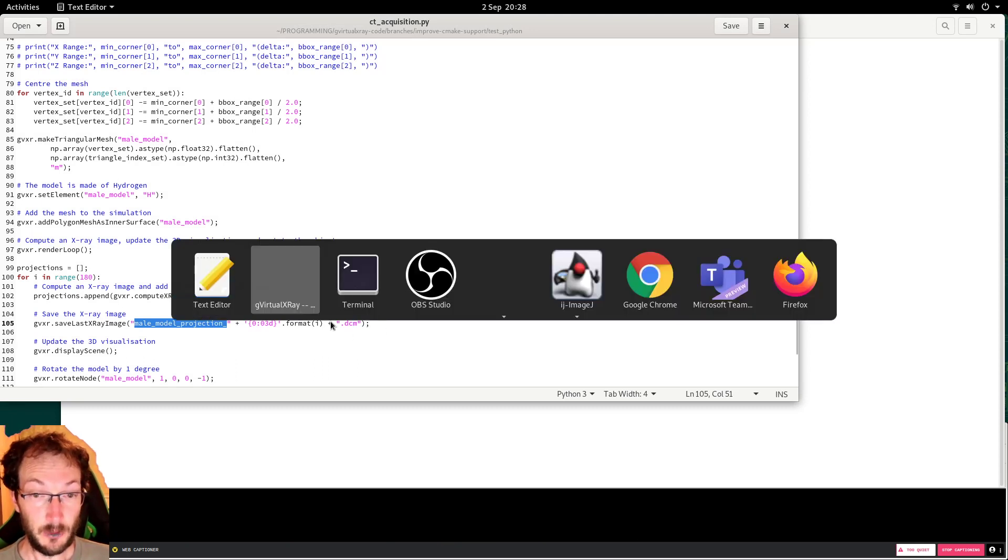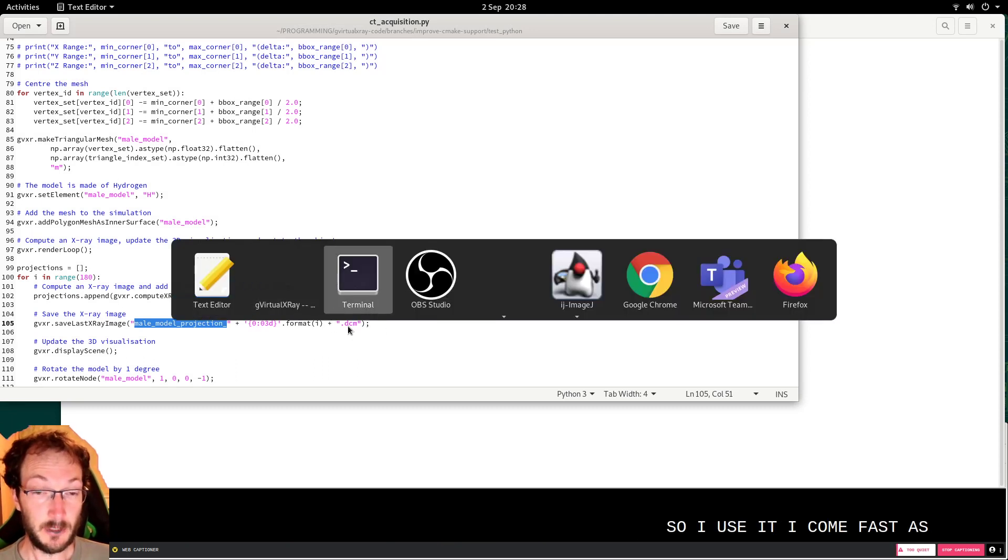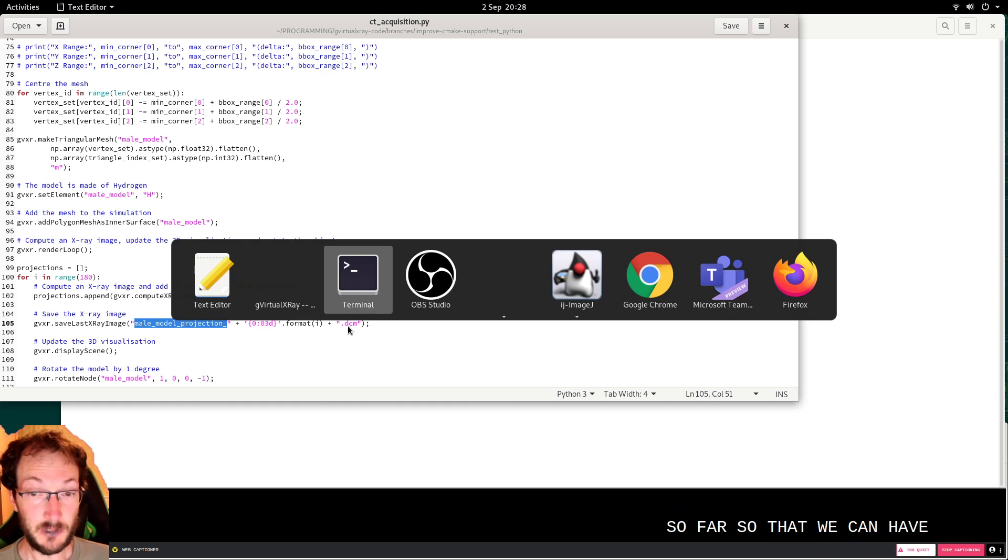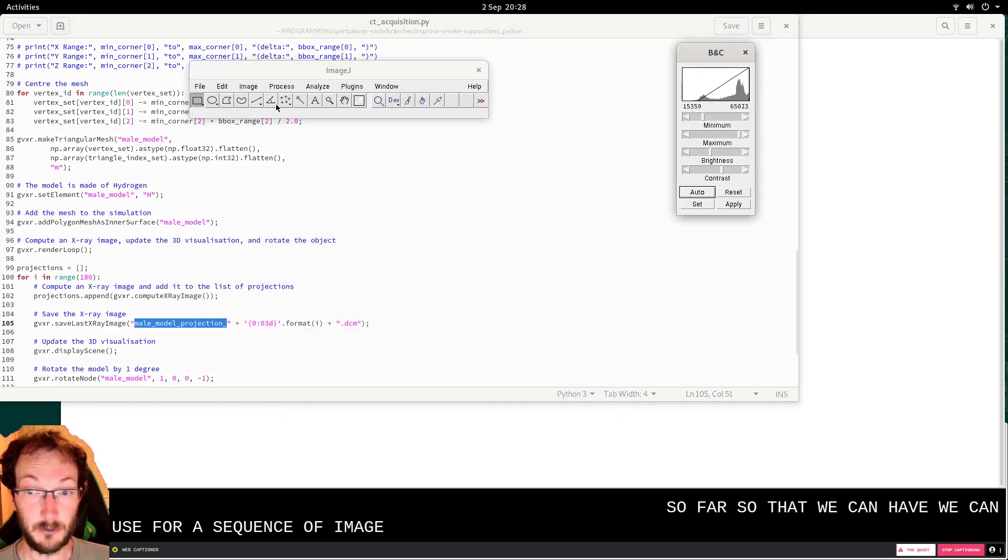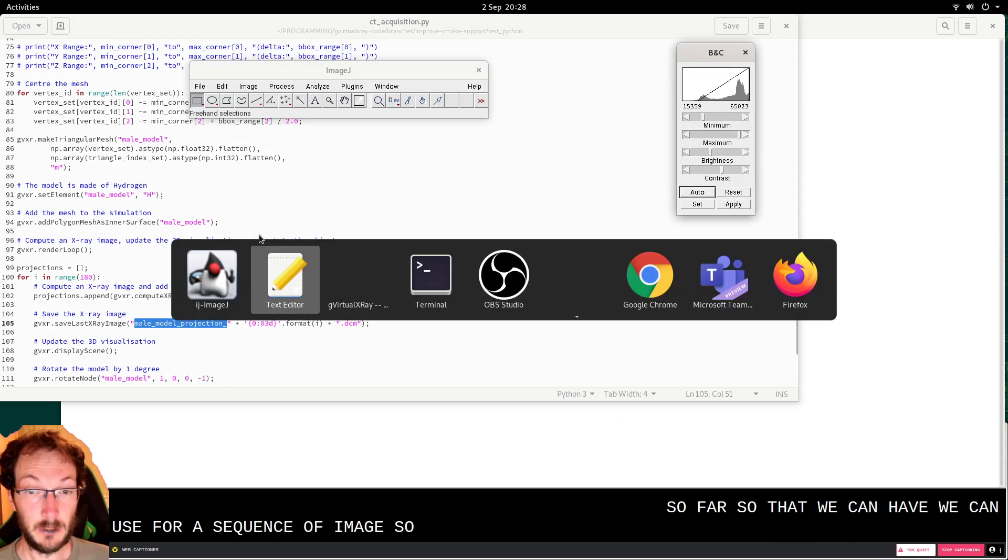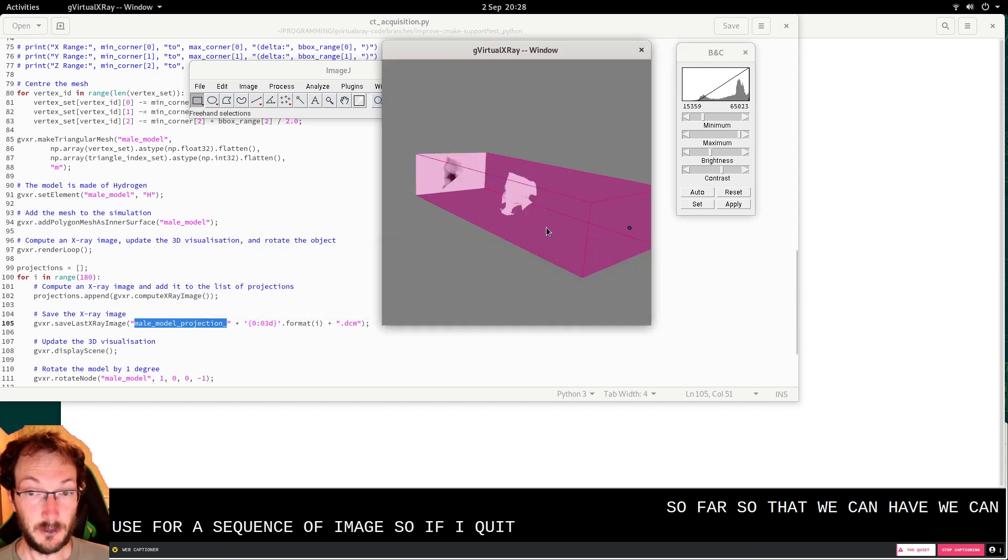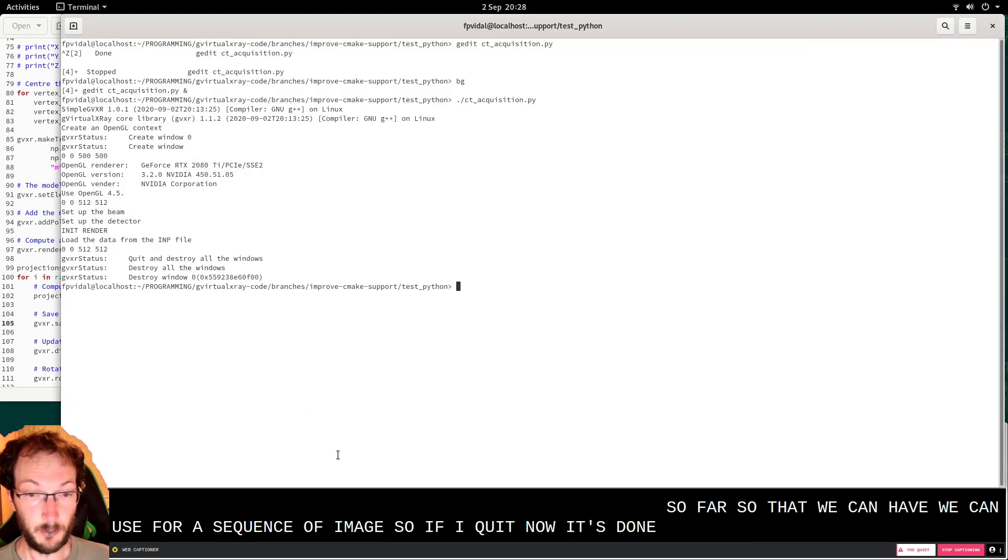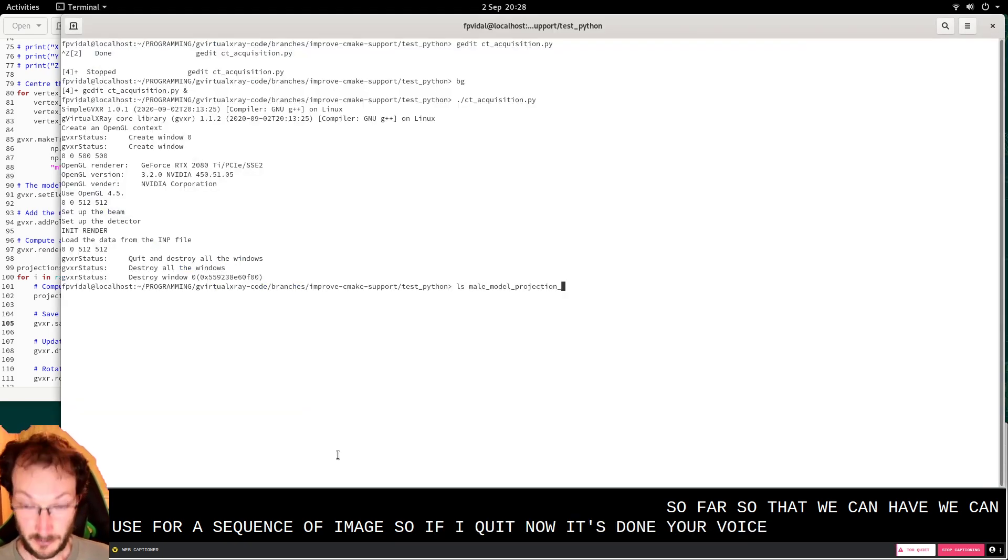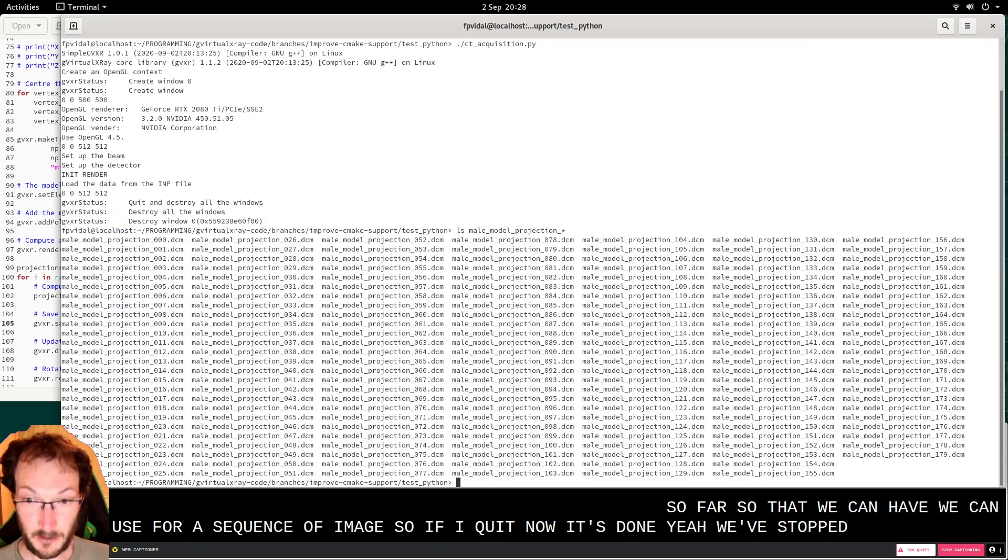So I use a DICOM file so that we can use ImageJ for a sequence. I should have plenty of files with that file format.